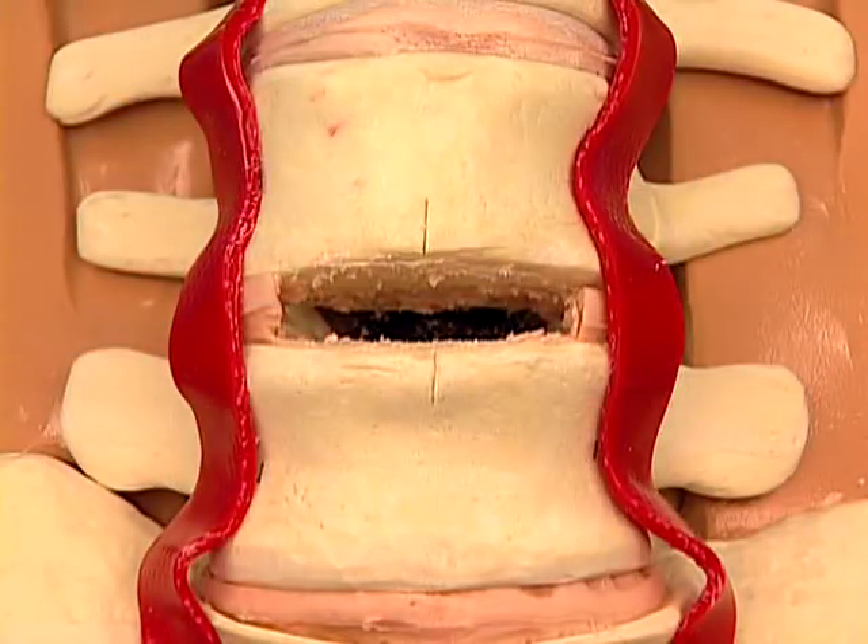Once a thorough and meticulous discectomy and remobilization has been completed, the disc is ready for ProDisc-L implantation.